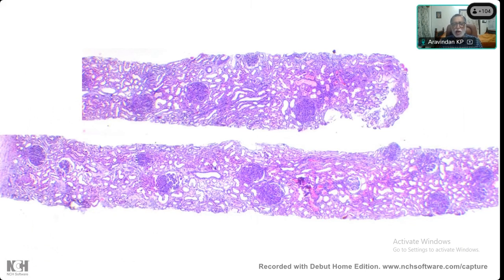What's your immediate comment on seeing this slide? Sir, what really strikes me are the hypercellular glomeruli. These glomeruli seem to be really larger, standing out, isn't it? They are very large and very angry looking, very hypercellular, large, angry glomeruli, just standing apart from everything else here. Very much enlarged, unlike the earlier cases. So we are dealing with uniformly proliferating glomeruli.